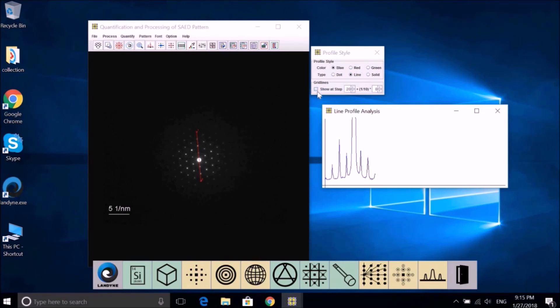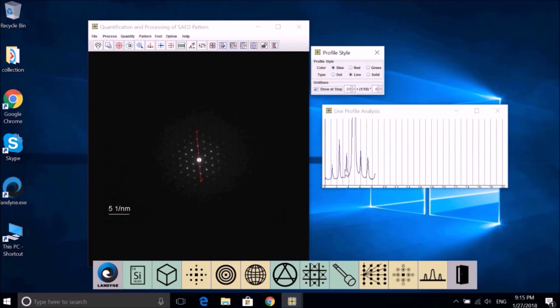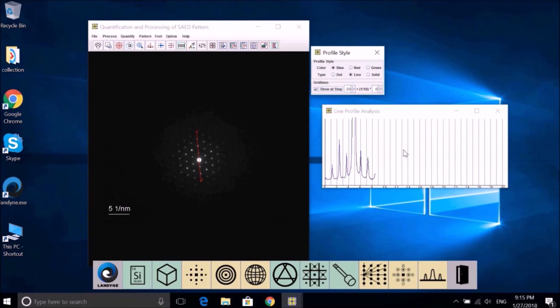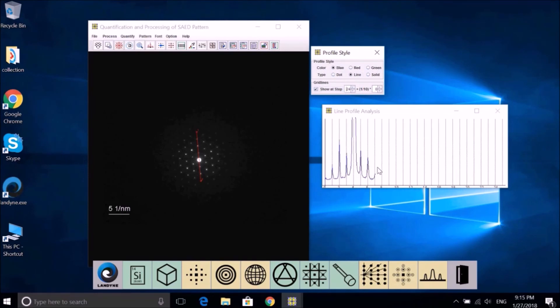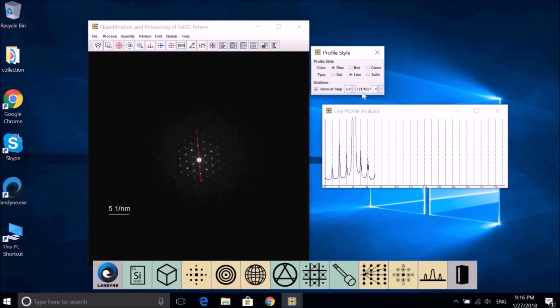We can show the intensity or spacing here. Show the steps. And then we can adjust step and 1 over 10 or 0.1 steps here to make all the vertical lines fit to the peak positions. This is perfect fitting now. So all lines are fitting to the peaks. And we can read this one is 24.0. Along this line, the pixel between the diffraction spots is 24.